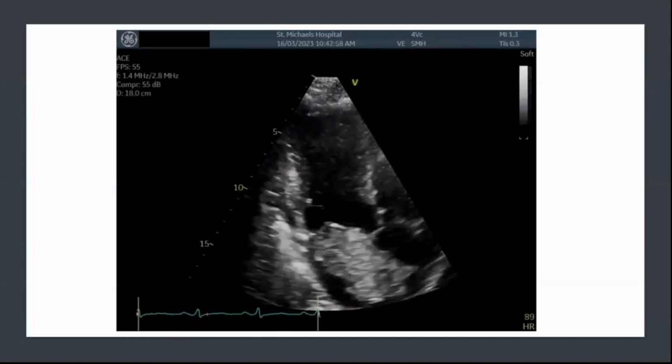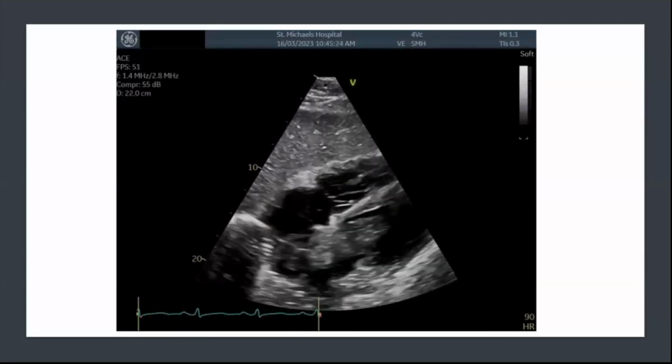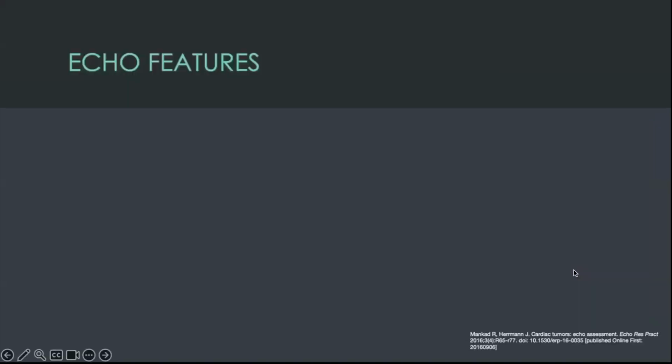And then this is the 2-chamber, the 3-chamber, and then the subcostal. So you can see it in all views. It's pretty big. I don't know why it keeps doing that. Sorry. It's big, eh? I call this kind of thing the C1 or the C2 sign: if we can see it, it's usually pretty big.